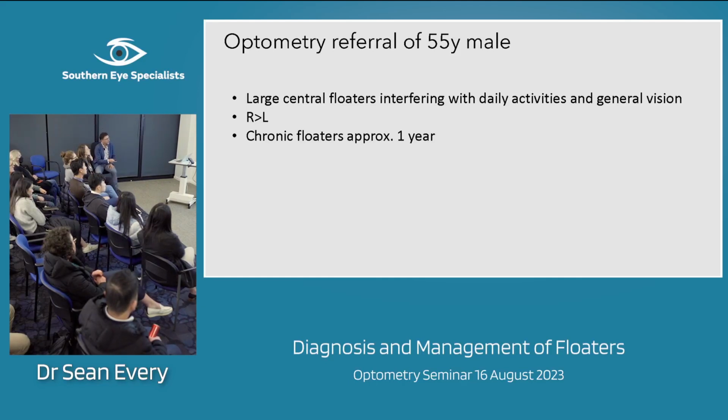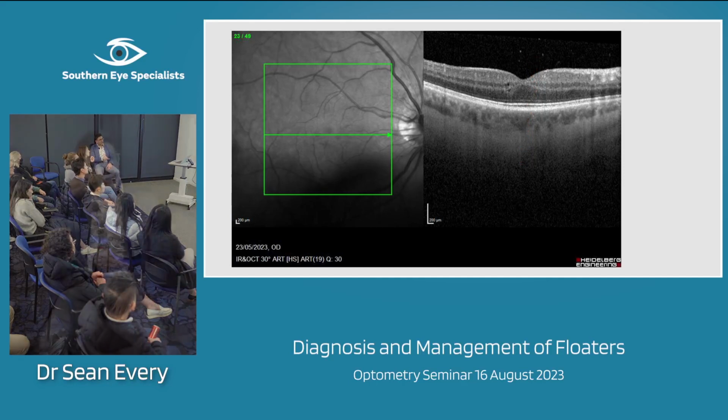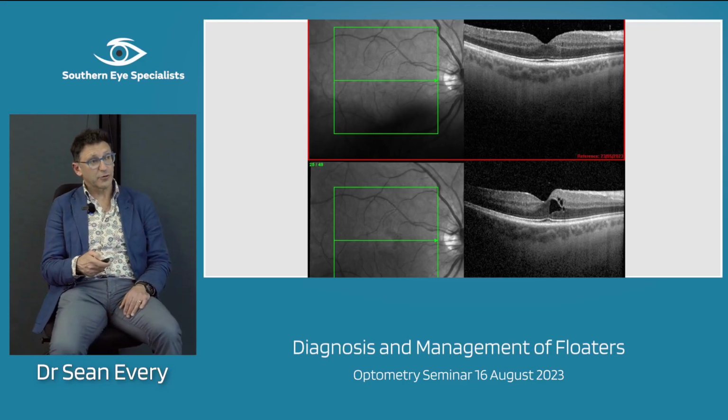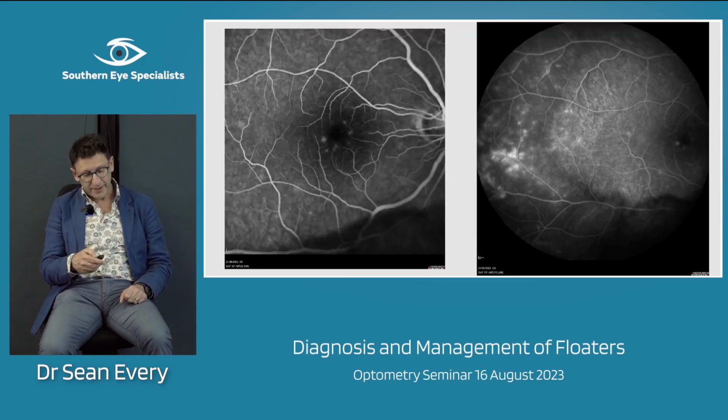And so you start having a look in there, and I did a macular scan, and it's like, wow, what's that? Okay, so this person just has a trace of cystoid macular edema, and you can sort of see a few dots in there as well, actually. Yes, it had a PVD, but this is actually interesting. So then I get them back to do some fluorescein angiography, and actually this is increased. And then this is the fluorescein.